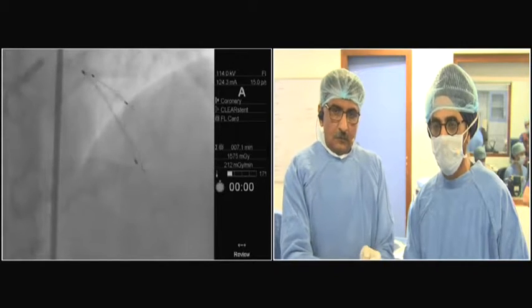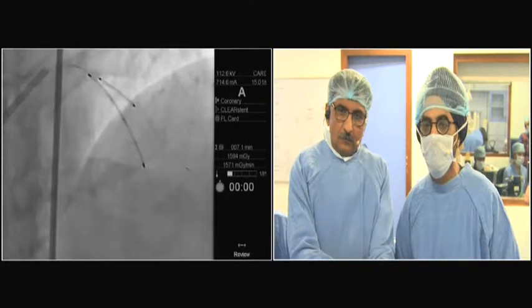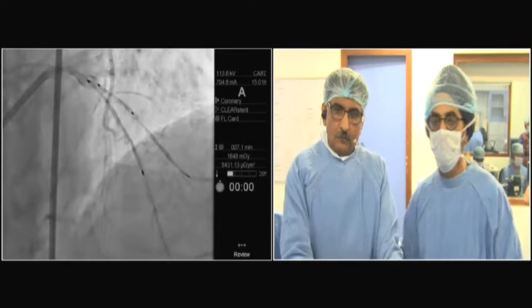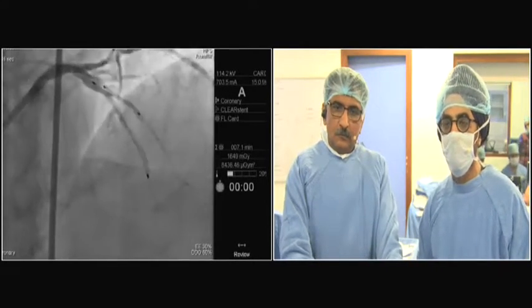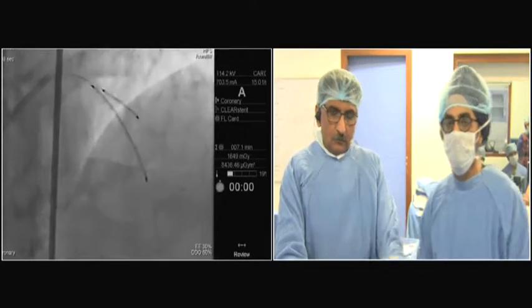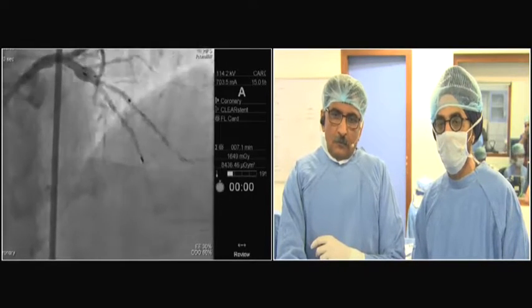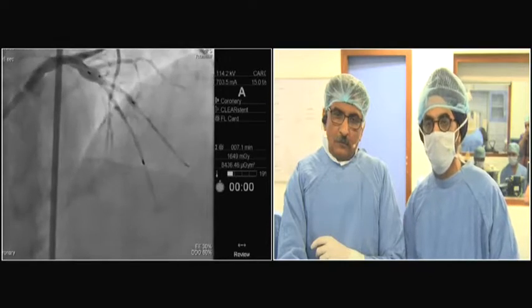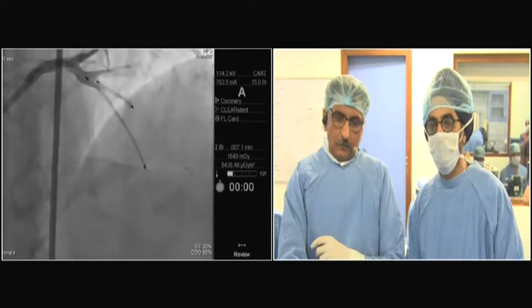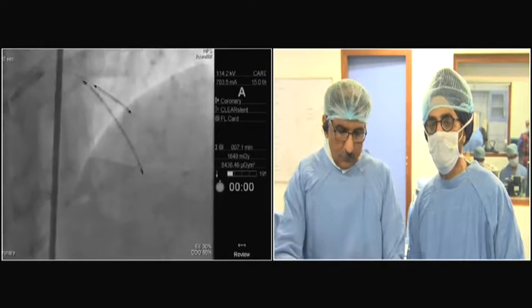Eve, any comments about the decision to do a 2-stent technique up front? It is certainly a case for double stenting, so we know that from the beginning. So the discussion is the way to perform it. I think we can do it using the provisional, and we can do what Charles Chu will probably say, that we can do easily, probably with DK crush. So both techniques, you don't have to think that provisional is only for simple cases.